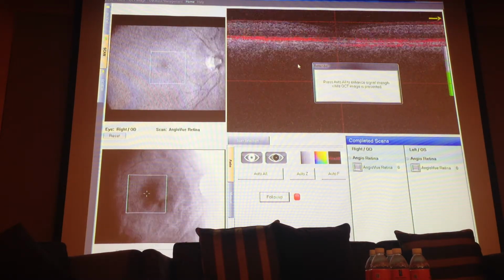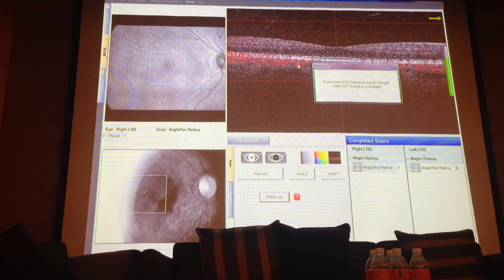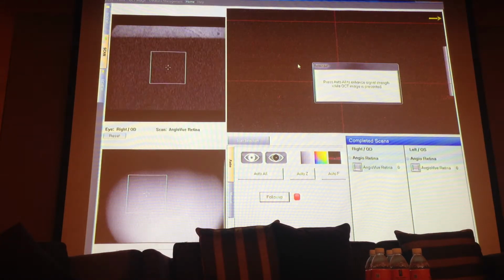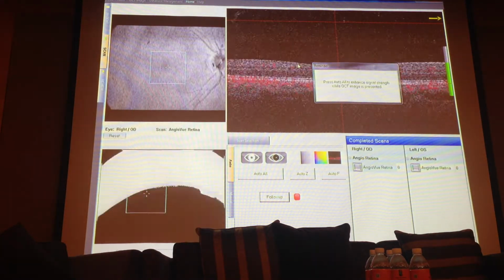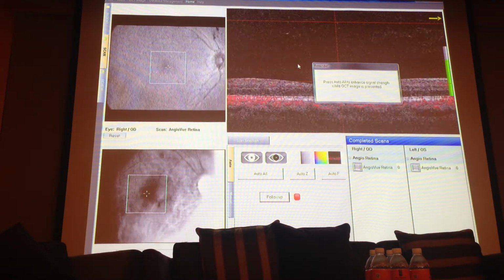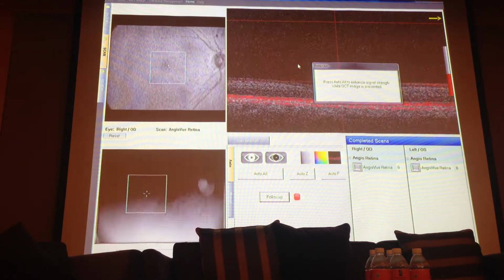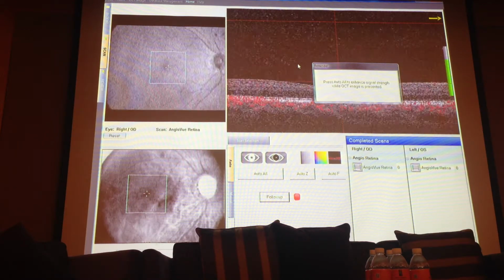Sometimes for ametropic eyes, usually myopia eyes, you get the B scan first, and you don't have a clear view of the infrared. But in that case, the signal of the OCT A is not optimized, so we can ignore the image in the B scan window. We just look at the infrared. Make sure there's no halo or shadow inside the infrared. Just like this, it's perfect.